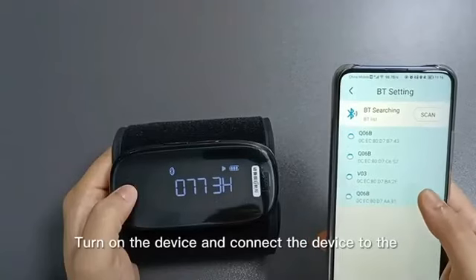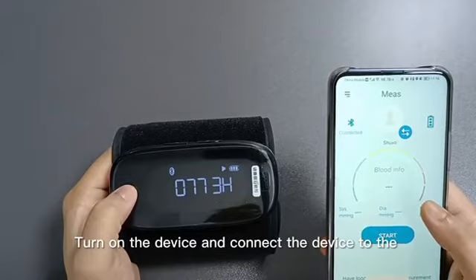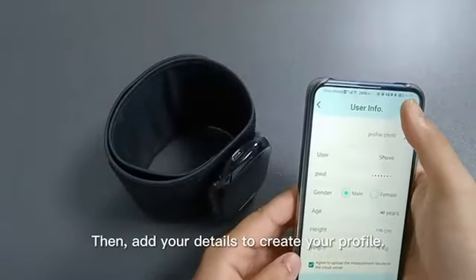First, turn on the device and connect the device to the HingMed BP app, then add your details to create your profile.